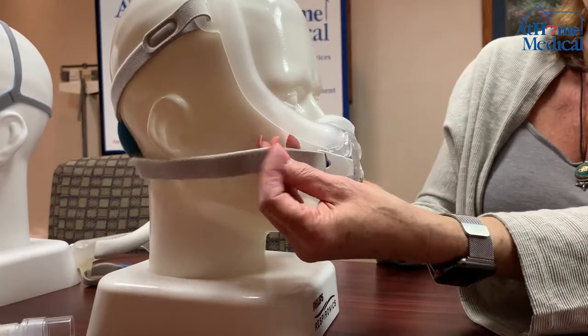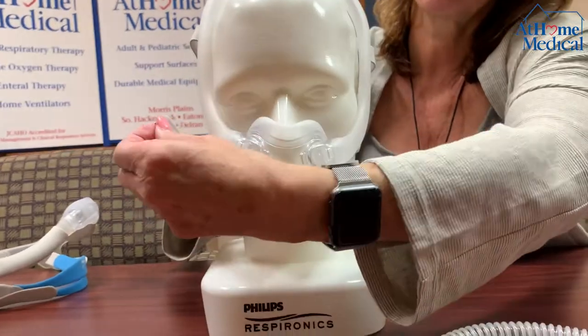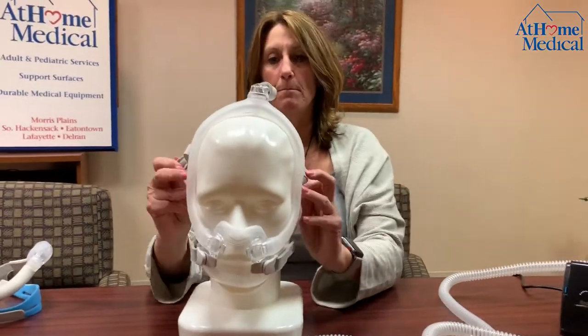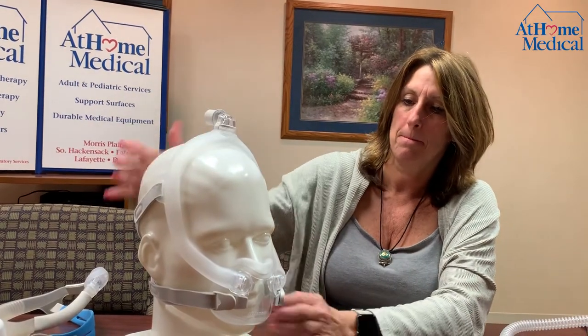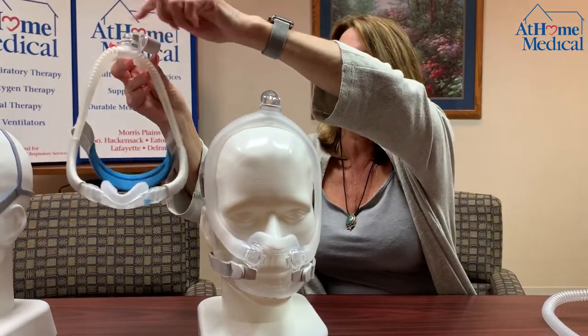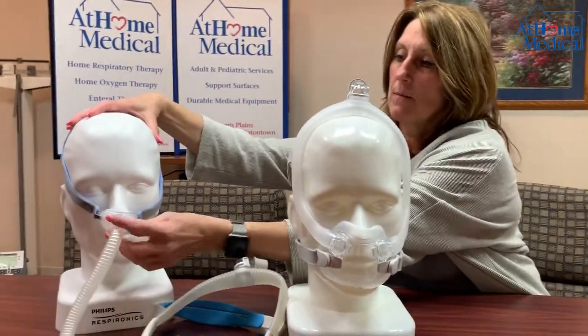You want to pull back on both sides. Pull back and Velcro together — same with the top: pull back and Velcro together. This mask is designed the same way — squeeze and pull out. Air will be coming out the front and out the top for exhalation. With this one it is the same way — out the top and through the front. And with the nasal pillows, it will be coming out around the front.